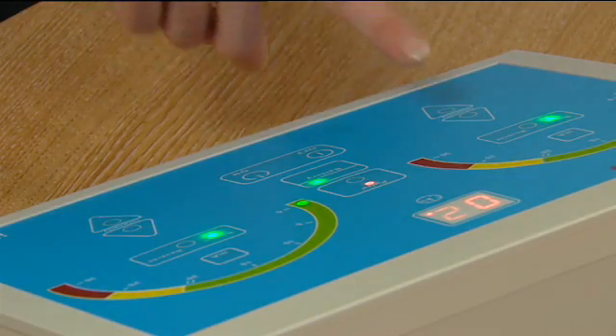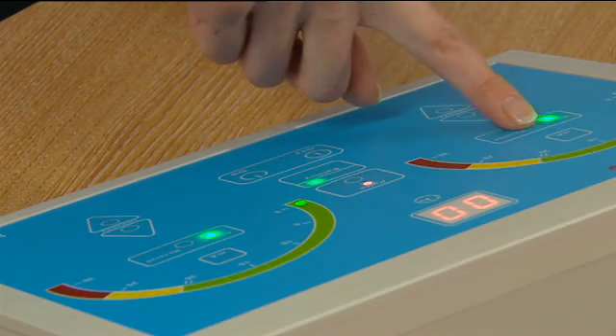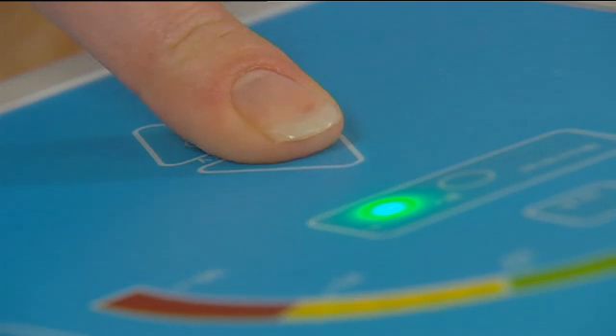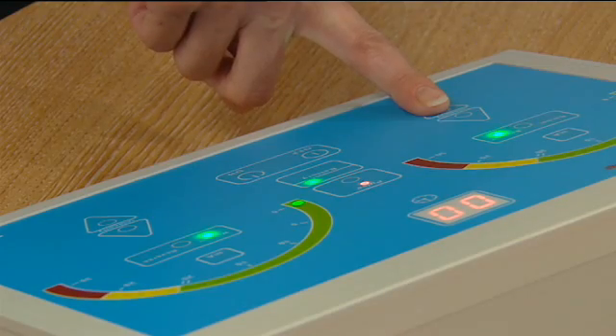After 15 minutes, turn the power down by depressing the downward arrow until there is no visible current. Change the polarity by depressing the normal reverse button. Restart the treatment again and after 15 minutes, turn the power down by depressing the downward arrow until there is no visible current.